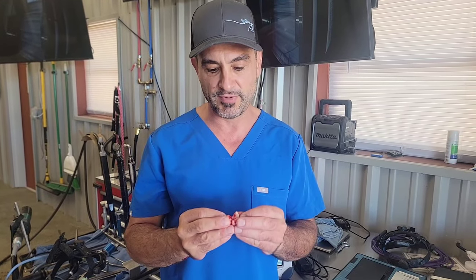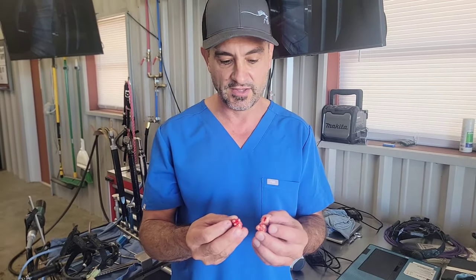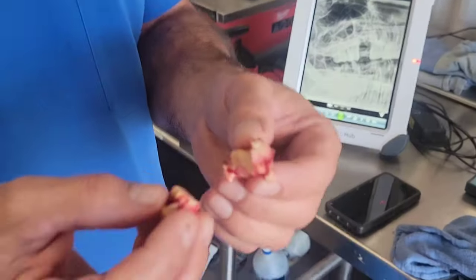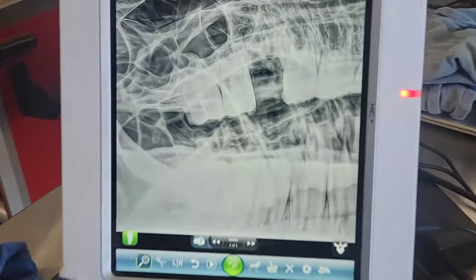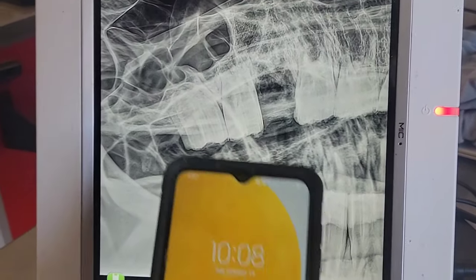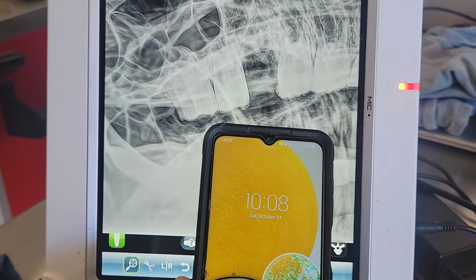I wanted to come back for a second and show what the tooth actually looked like. Here's where we cut it in the middle, and then we'll show you on the x-ray — we took an x-ray and there's what it looks like. Everything's very clean. And just so you know we didn't go back and do more work, it's only 10:08.